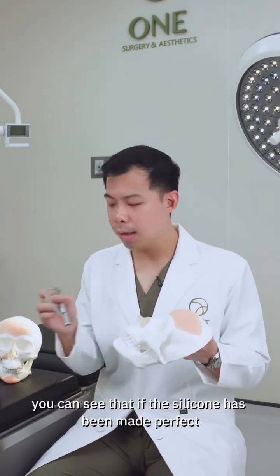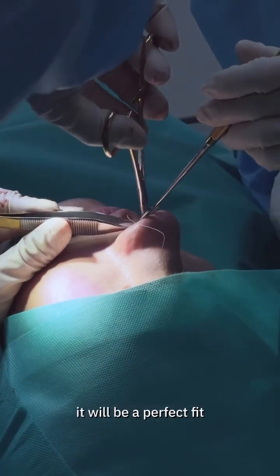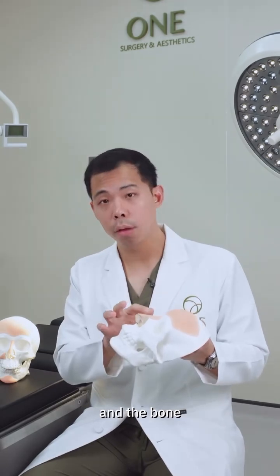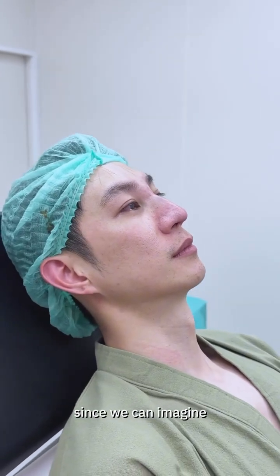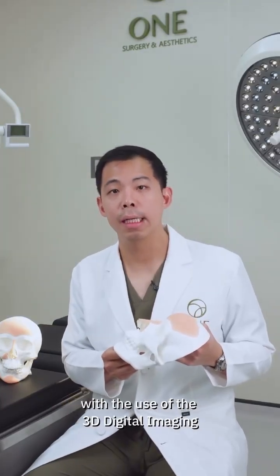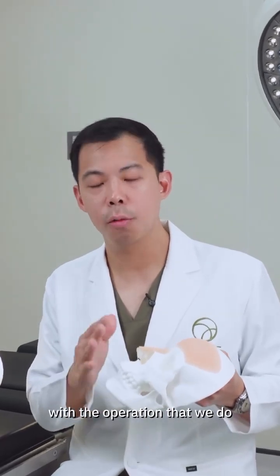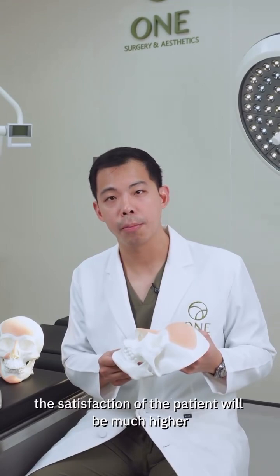But here you can see that if the silicone has been made perfectly for the patient, it will be a perfect fit such that there is no gap between the silicone and the bone, and hence these complications are much less. And also, since we can imagine what the patient is going to look like with the use of the 3D digital imaging, the expectation of the patient will be aligned with the operation that we do, and we expect that the satisfaction of the patient will be much higher.